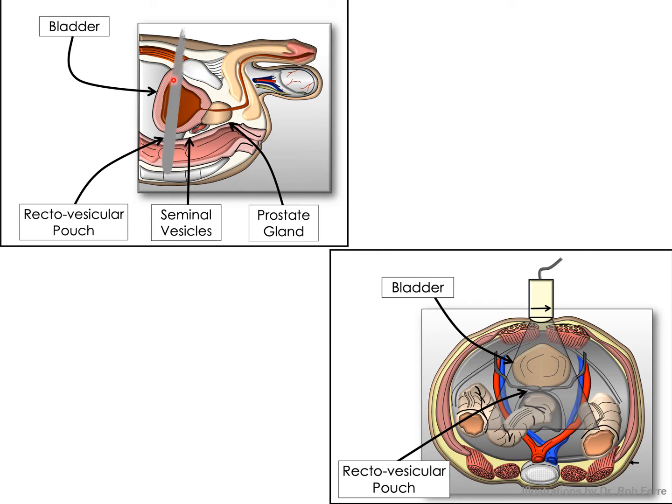And then you should be able to see the bladder and rock or fan the probe over the bone and aim down into the pelvis. So usually start with the probe marker towards the patient's head, and then rotate the probe marker towards the patient's right. This diagram's a little confusing because it's actually you looking down on the image. So this is the probe marker towards the patient's right so that you can see the bladder in the near field and the seminal vesicles behind it.